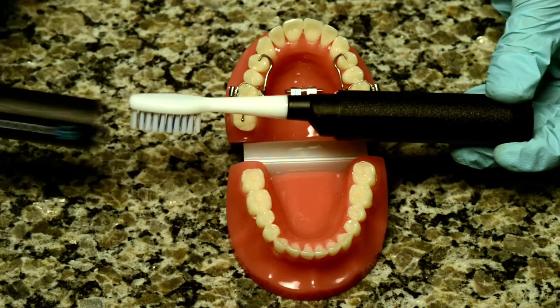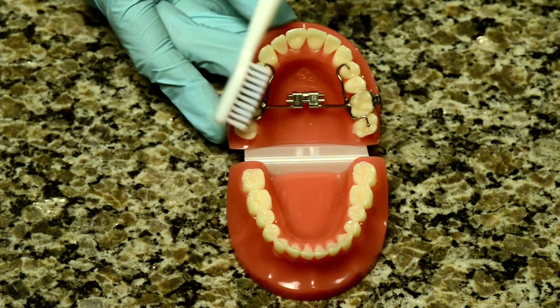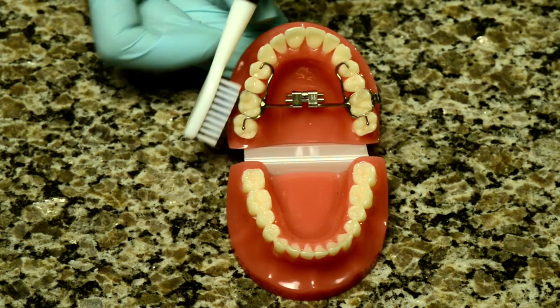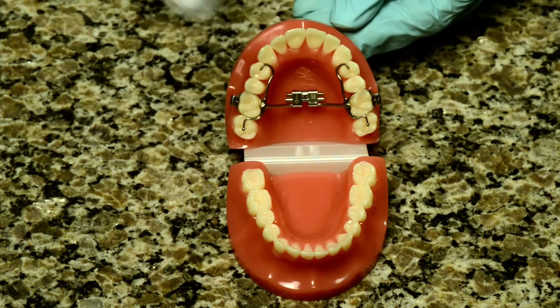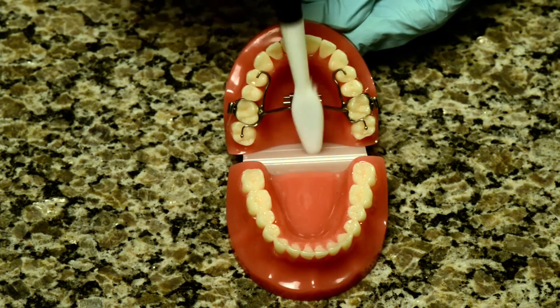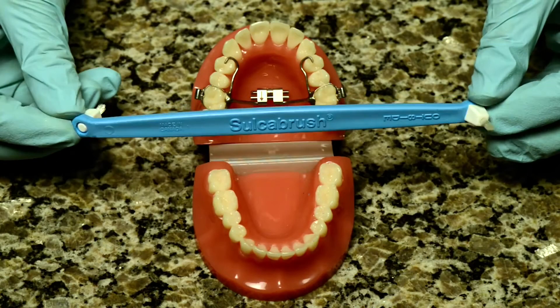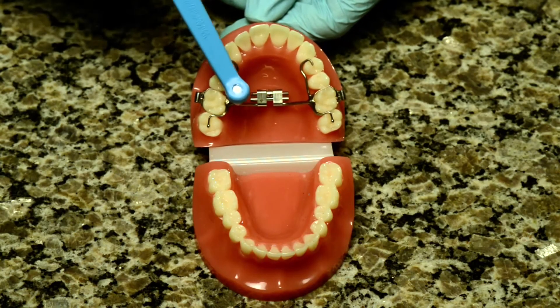After eating you will need to rinse with water to get rid of food stuck in the space between the expander and the roof of your mouth. Be sure to brush three times per day — in the morning, after lunch or when you get home from school, and then before bed. Use your toothbrush to brush your appliance as well as your teeth. If the RPE looks dull or fuzzy then it is not clean — it should always look silver and shiny. You may need the help of a sulca brush to get along the roof of your mouth clean.